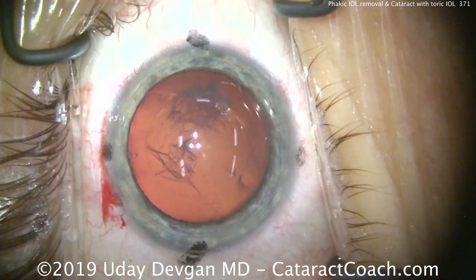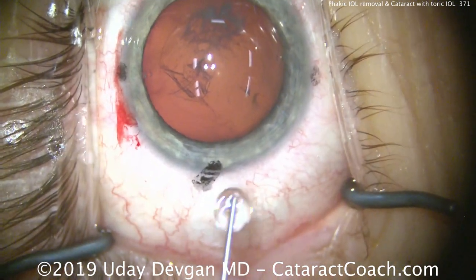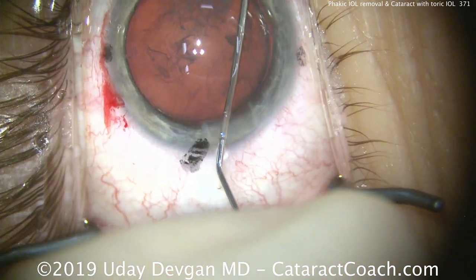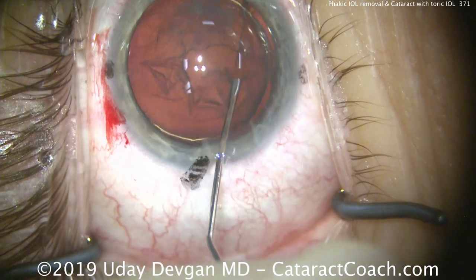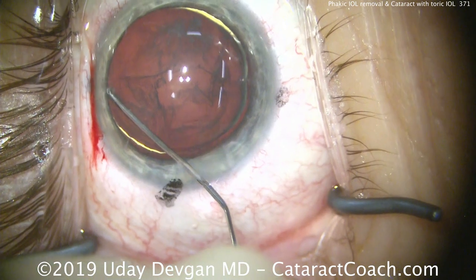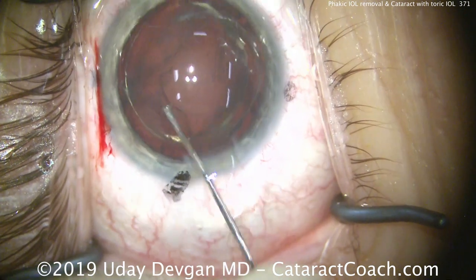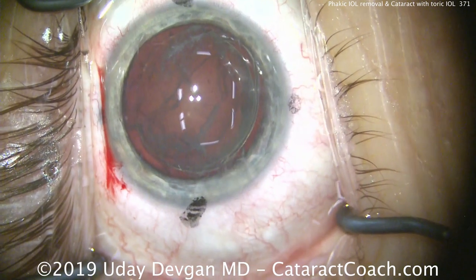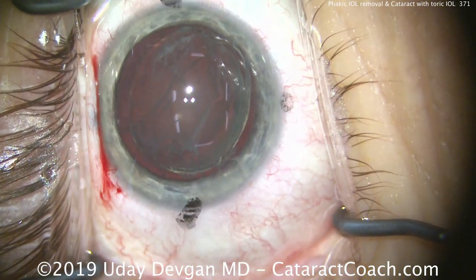This patient is on the young side, so we'll do hydrodissection and get the lens nucleus out of the capsular bag. Not much phaco energy is needed because the lens is soft due to the patient's young age. A little bit more hydrodissection — there's the nucleus out of the capsular bag. We'll use the phaco probe to emulsify it, and it should go down pretty quickly.